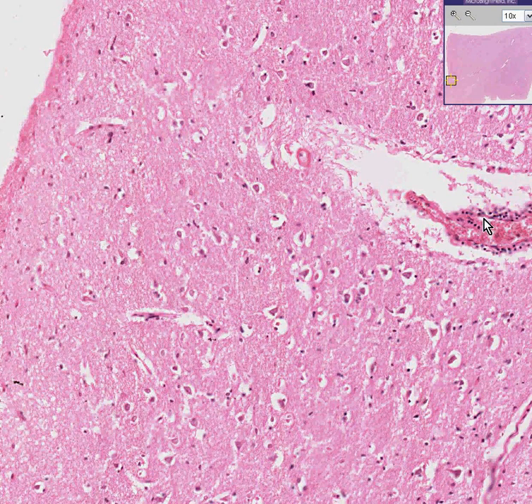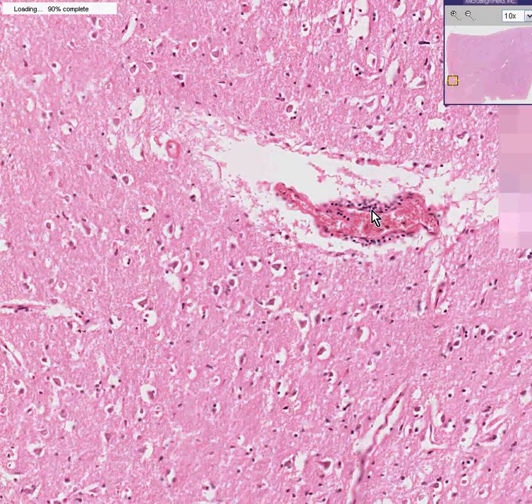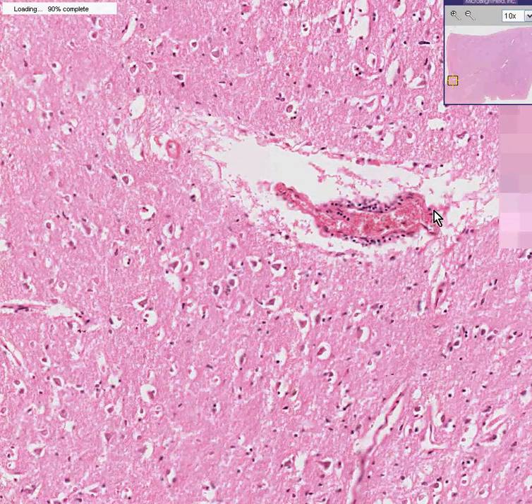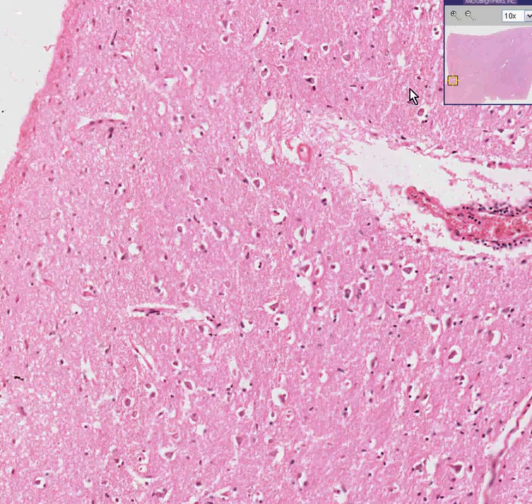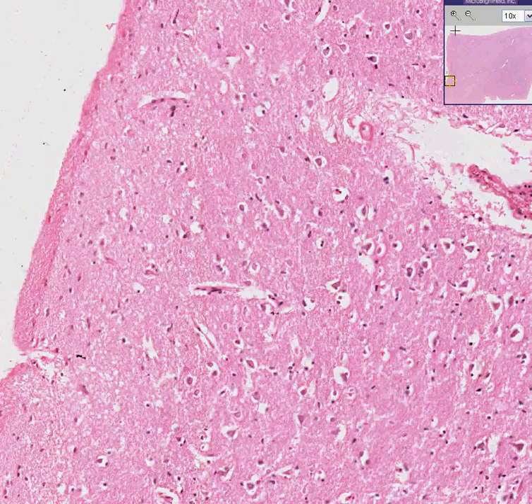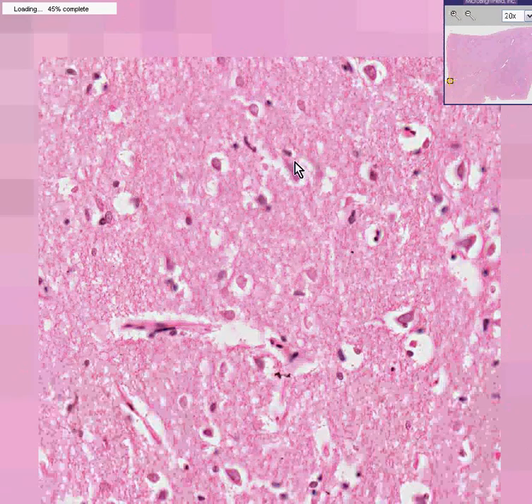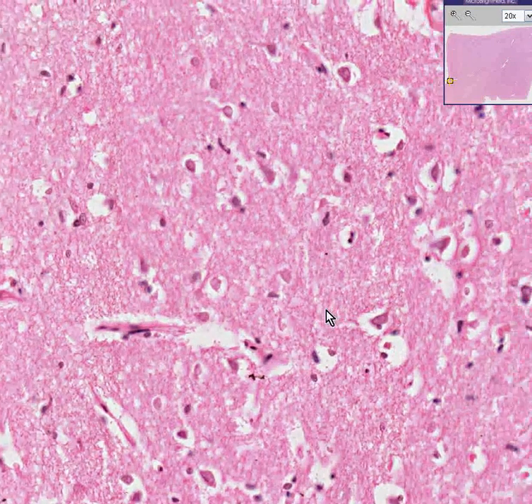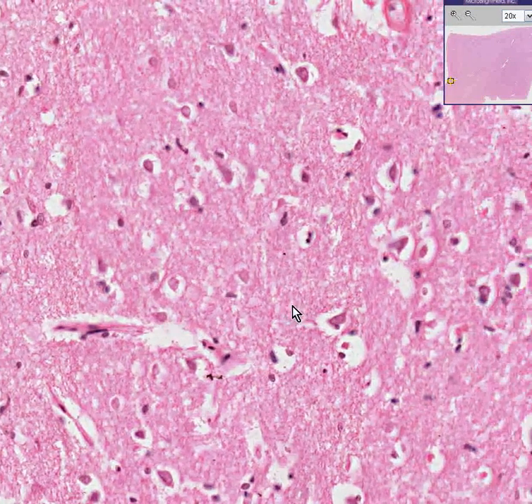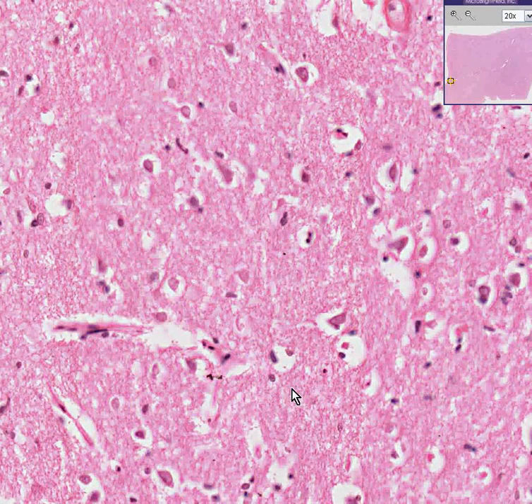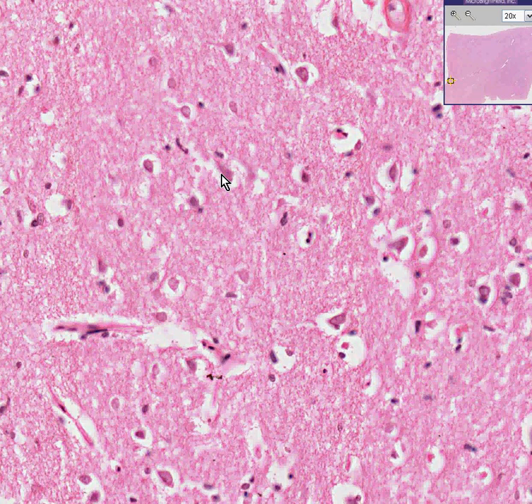Here is a small intracerebral blood vessel. Here are a variety of both glial cells, which are most of the small nucleated cells here, as well as the larger neurons like you see here and here.